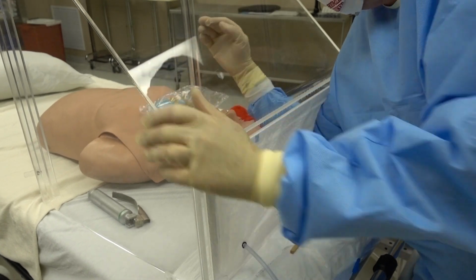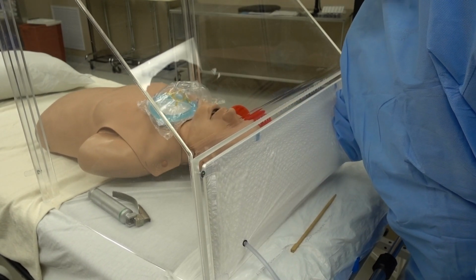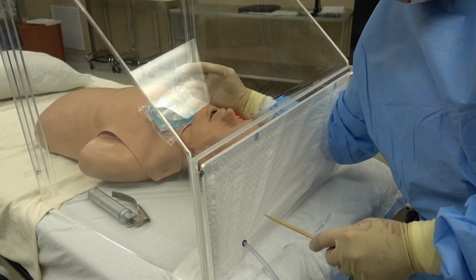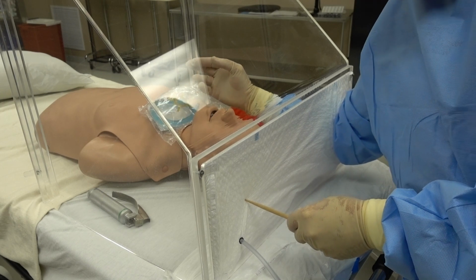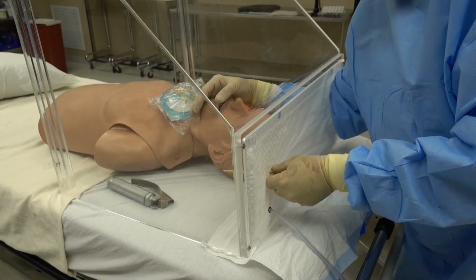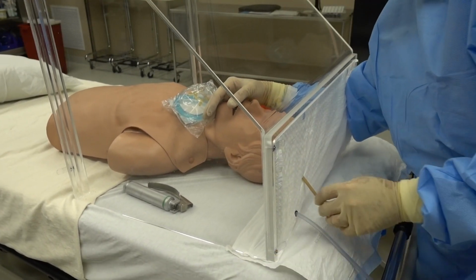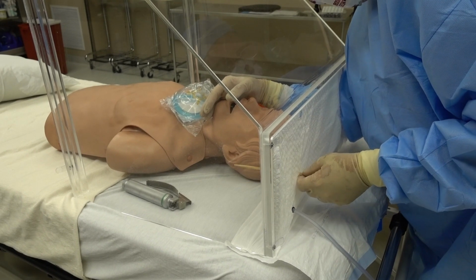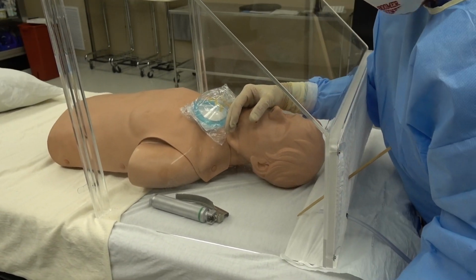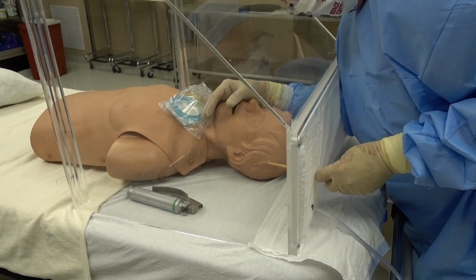That's critical that you're up to your elbow, because you've got great mobility. You can move around, you can do anything you want in here. I hope you can still see. Again, make another opening wherever you'd like it. Just punch it clear through. I'm going to turn the bed a little bit. So that's punched clear through both sides. And again, let's see if we can get it where you can see my hand coming through there. I'm doing this by myself again, so it's not as easy if you had an assistant.